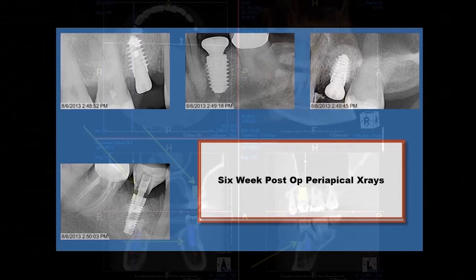You see we used a large diameter implant on the lower left side, because the bone is not very dense in here, and when you get in there, it feels just like this looks. There's just not much density there. So we're going to use something wider in diameter that engages the buccal and lingual cortices, so we get better primary stabilization that way. In the lower right side, a tapered screw vent implant.